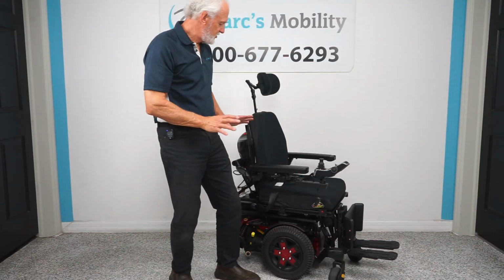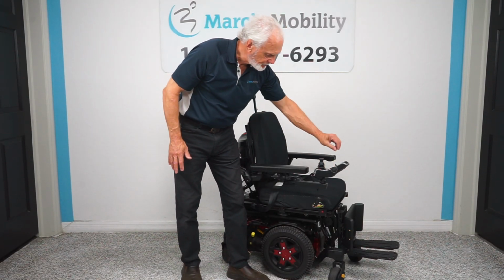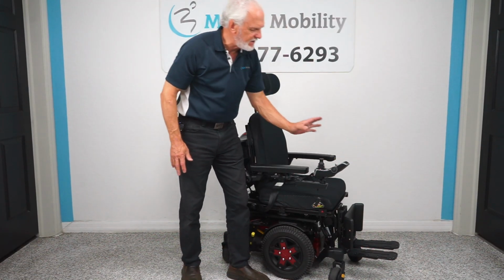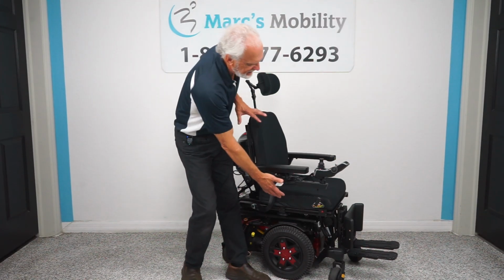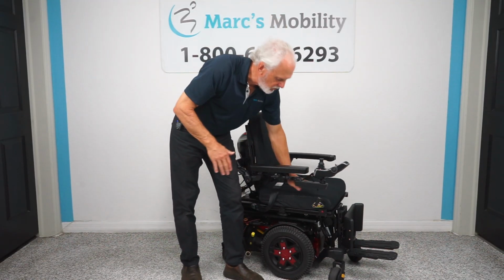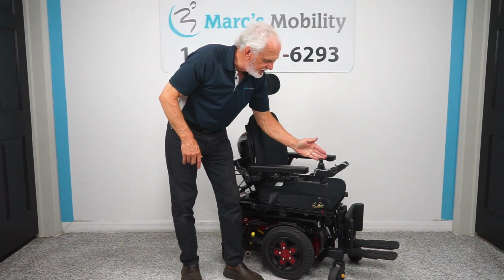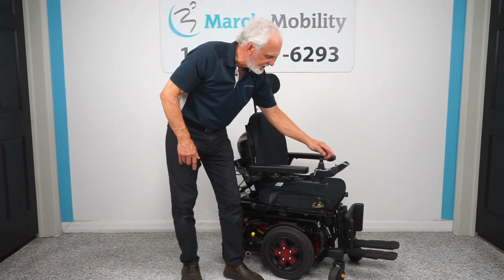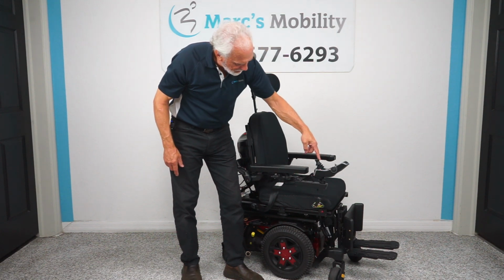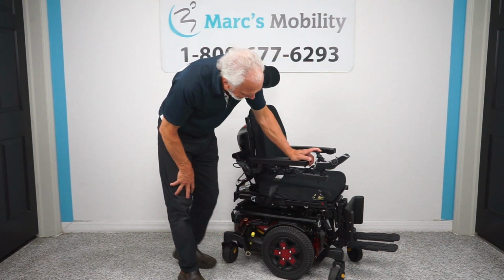All the functions on this chair have to be worked through the joystick. If you go here where your knob is, keep pushing the knob forward until you see a picture of your seat. As soon as you see a picture of the seating system on the screen, if you want the seat lift to go up, you just want the bottom cushion to be yellow. If the bottom cushion is not yellow, just keep moving this sideways like this until you see the bottom cushion yellow. Once it's yellow, then you can just use this, go backward, and you'll see the seat lift start to go up. It's just amazing, folks, okay?